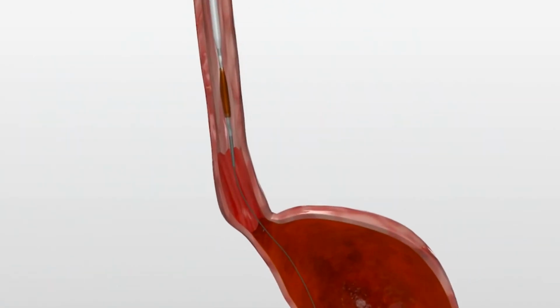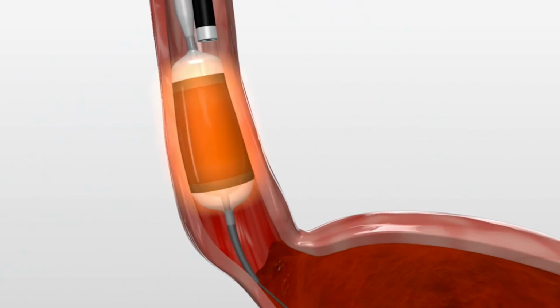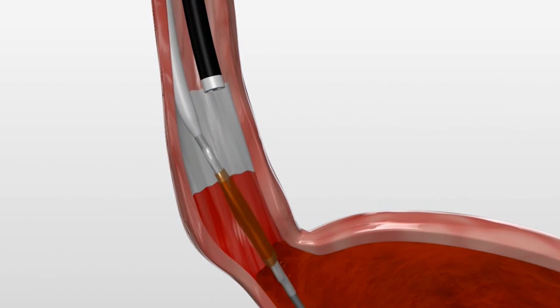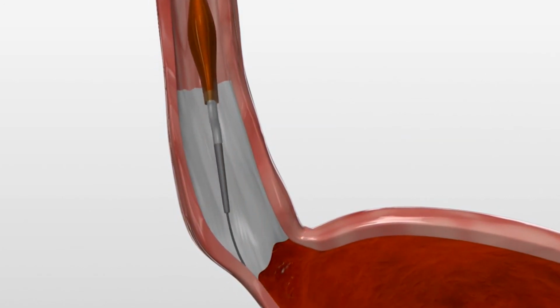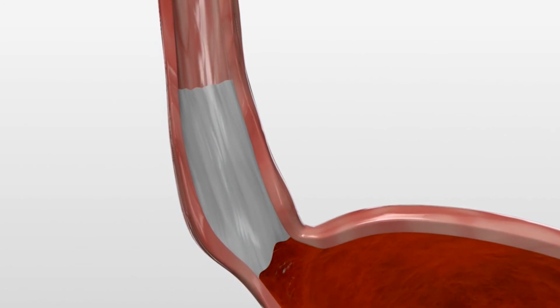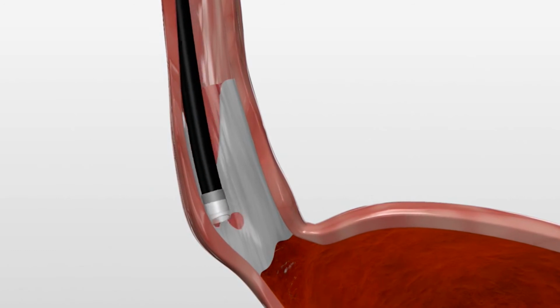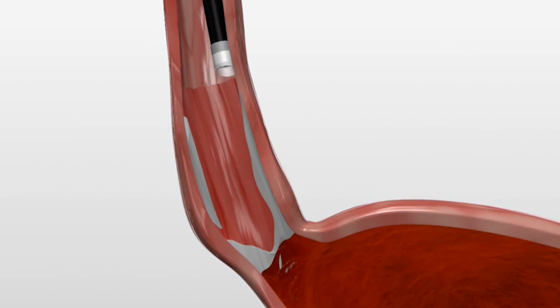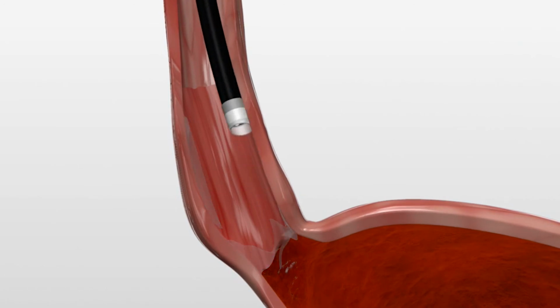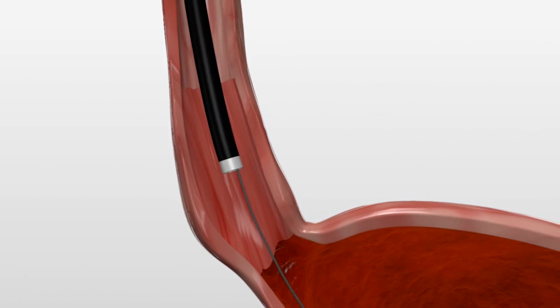In this animation, we demonstrate how we pass the catheter. This is a demonstration of a 360-degree catheter. That means it's trying to ablate the Barrett's all around. The scope helps us see the area that we're treating. We're trying to make that area of Barrett's esophagus return to normal tissue. After we ablate the surface of the esophagus, we scrape off the tissue that we don't want in the area. And then we repeat the treatment another time for a second cycle.